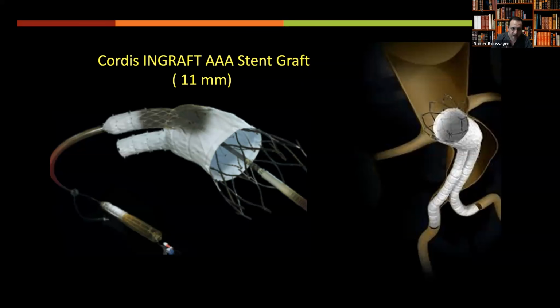And I went there, I took a course on this device, and he brought me a 10 cc syringe, and he put two limbs in it, and it looks fine to me. So this is something you can consider.